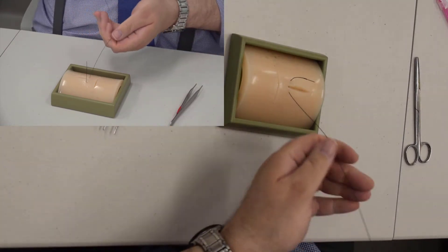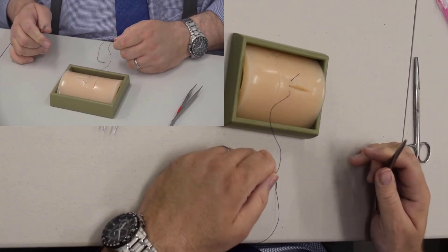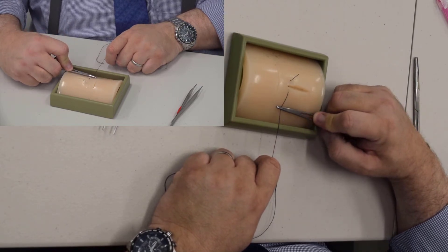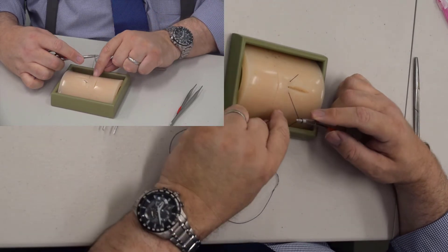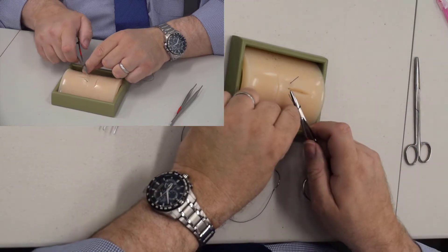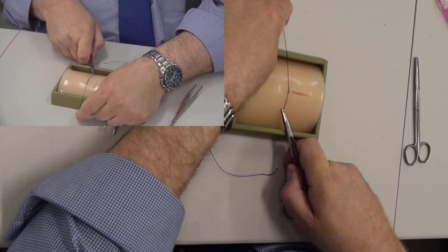Now we're going to tie with just our instruments. Pull until you have about a half of an inch of suture left. Put your needle holder on top of the suture and make two throws — one, two. Come across, grab the tip of the suture, pull it through. I crossed my hands when I did that.